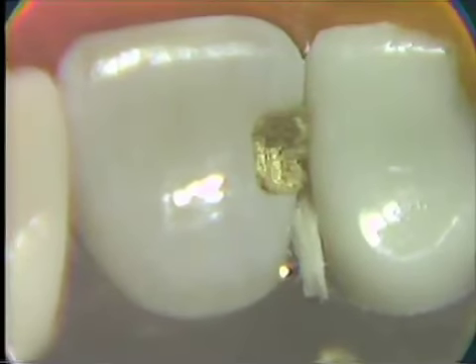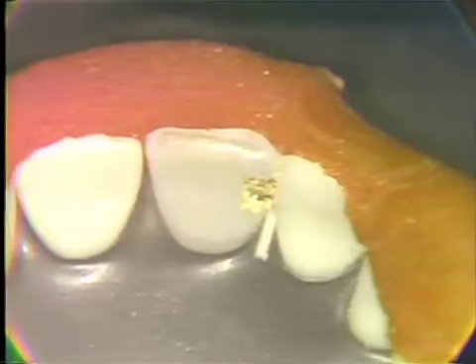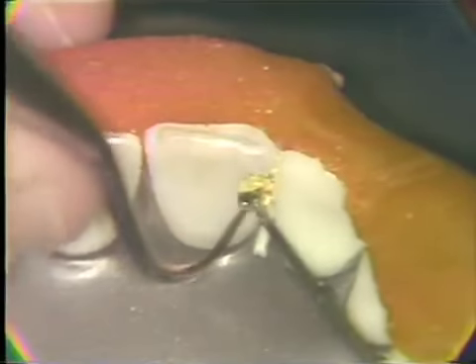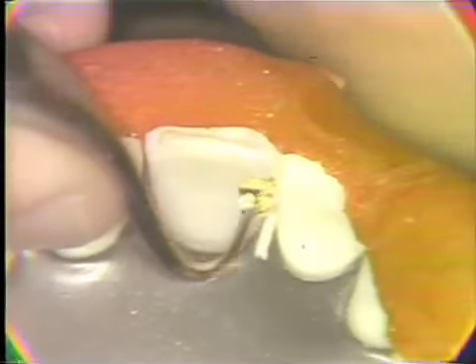So the continuation of condensation will go on piece by piece until we have built our normal contour against the acrylic matrix, and contour against using the adjacent tooth as somewhat of a matrix, also bringing out that normal lingual surface contour. We're nearly completed with the condensation. We have still another piece yet to place in this cervical area.